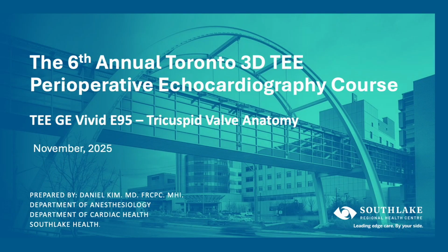This is the 6th annual Toronto 3D TEE perioperative echocardiography course. This is the tricuspid valve anatomy as presented on the GE Vivid E95 platform.